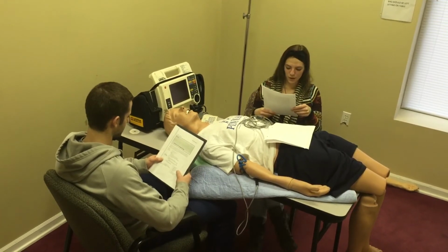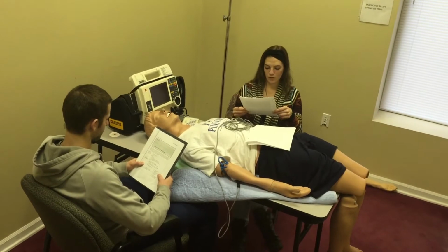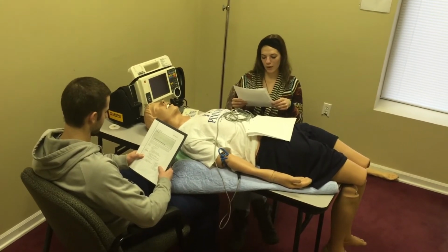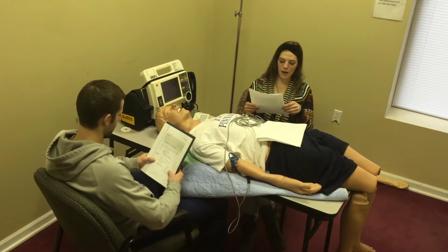This patient is a 65-year-old woman who has complained of generalized weakness and depression for the last 2 weeks since her husband died. She was found unconscious lying in the garden by a family member. Her daughter thought she was breathing at first, but then started compressions just before your arrival when it became obvious the patient was dead. Quick look shows the rhythm above, the patient is pulseless and apneic.